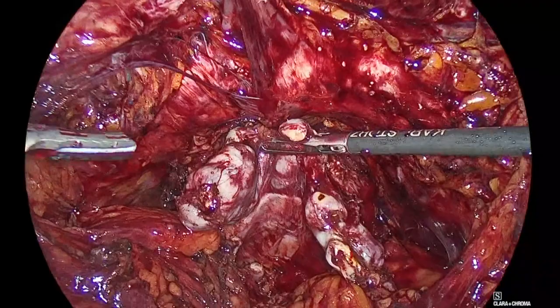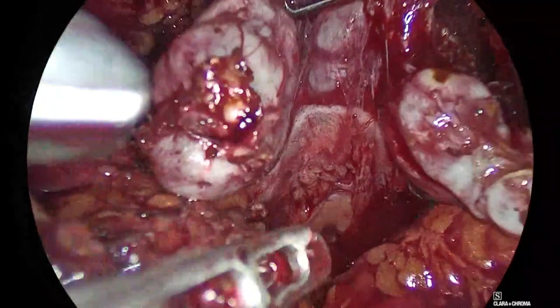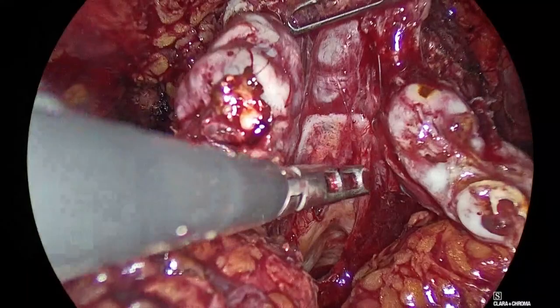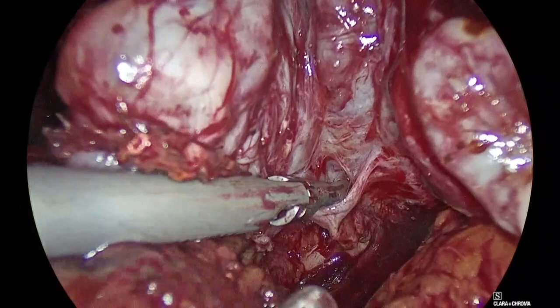Good. So look. Panagiotis, here with your suction, please. Look, this is through and through the peritoneum. You see this? Come closer, Padeli. It's going on the pouch, transperitoneally. So what we do here is exactly this move. This is the Denonvilliers fascia. And this is the plane we go in. Right and left dissection. You see this? This is intrafascial here, huh?